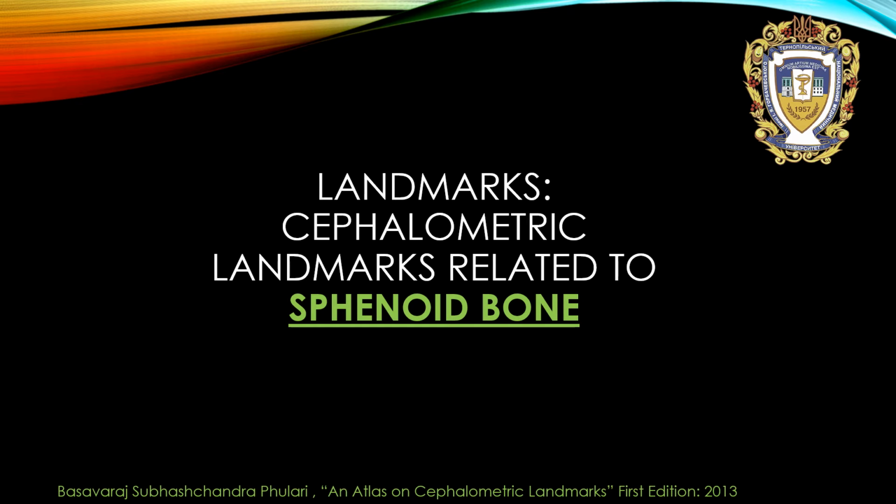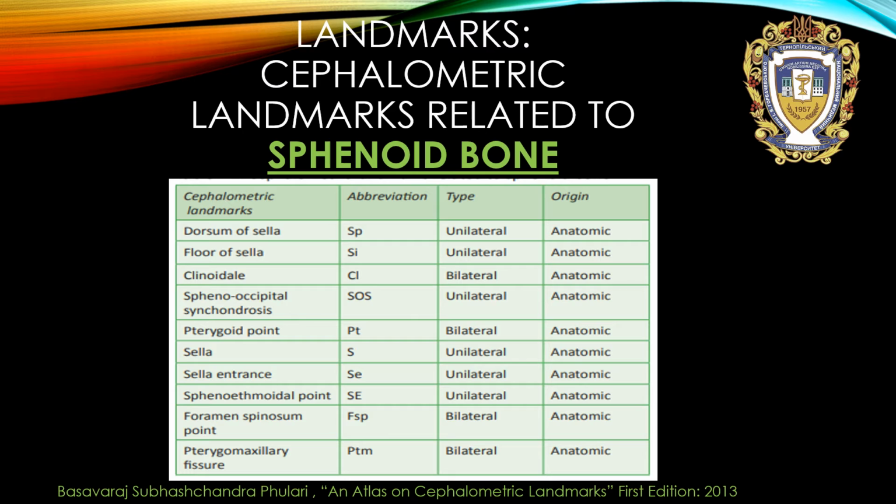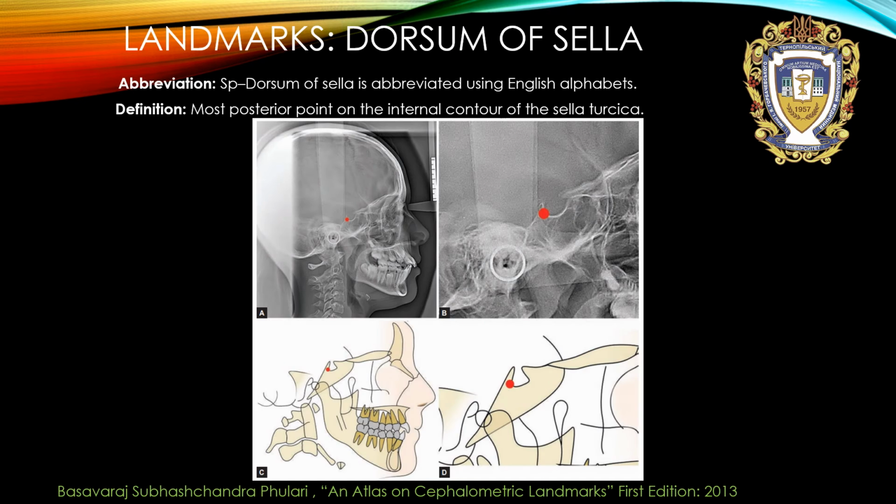Landmarks related to sphenoid bone. As you can see, there are so many points, and the most important are next. Dorsum of sella.